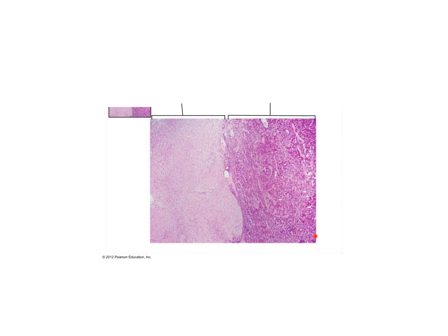So the anterior pituitary, you should be able to see the blood vessels. All this lighter colored red or pink, those are the blood vessels and the red blood cells. So this is going to be the anterior pituitary right here on your right-hand side. And then on the left-hand side, this is going to be the posterior pituitary. So if you see this picture on the test, you might just need to identify it as the pituitary gland, or specifically the anterior pituitary or the posterior pituitary.